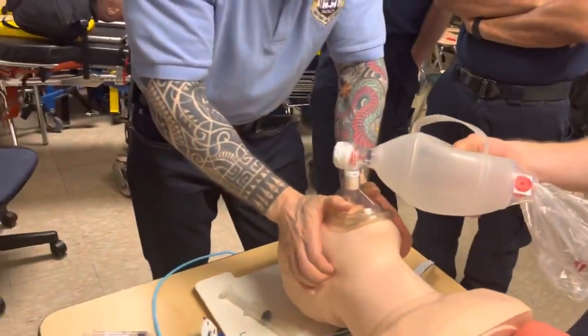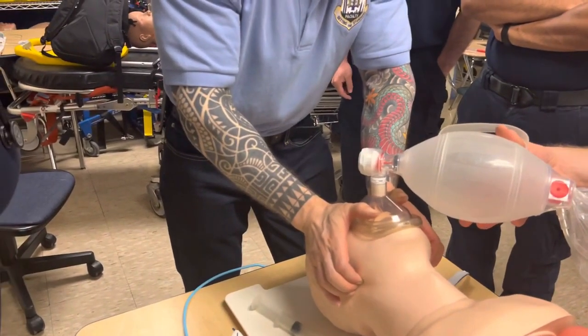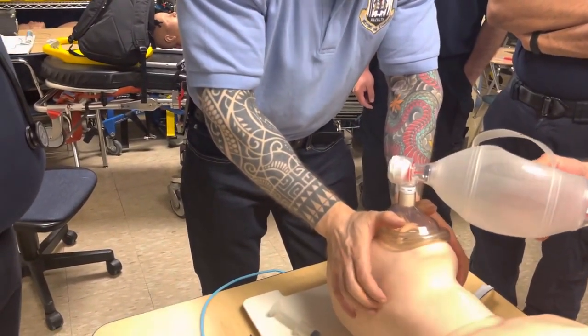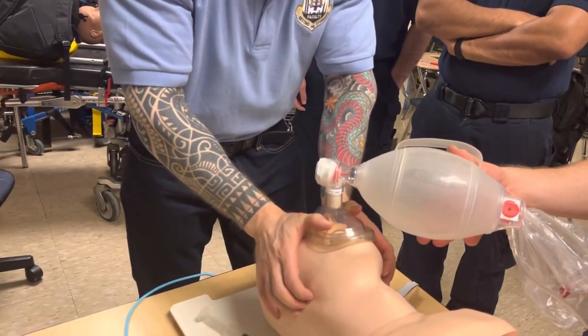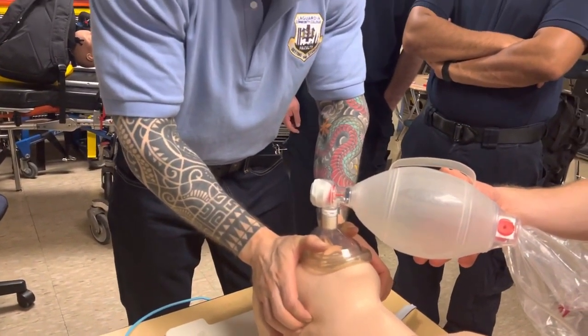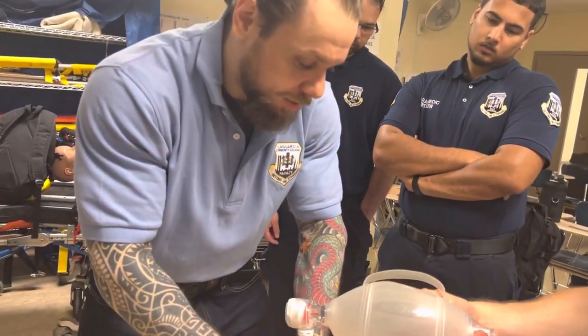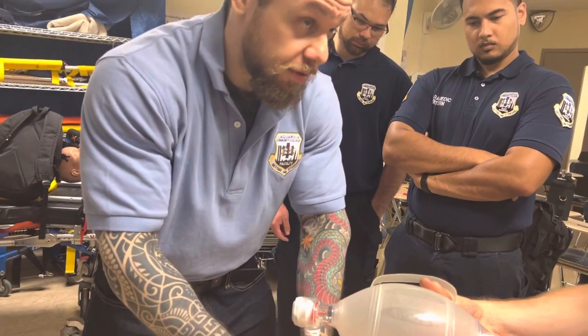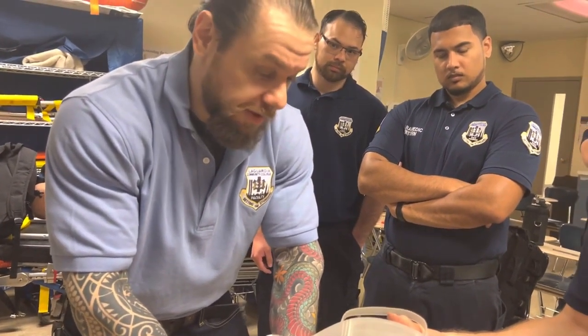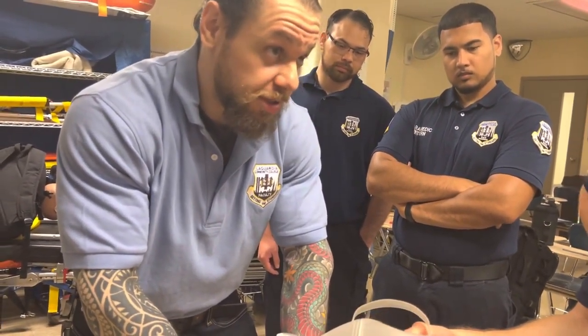So you relax. Why do I start counting at 2? Because the breath is delivered over a second, right? So 2 1,000, 3 1,000, 4 1,000, 5 1,000, 6. So the breath is delivered over a second, so I don't count 1. On 5 you engage, on 6 he delivers the breath.